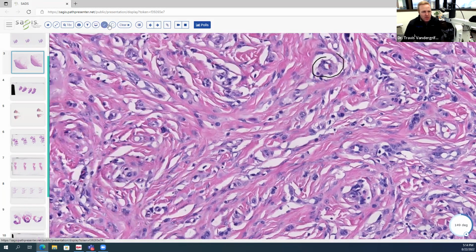In addition to that population of blood vessels, you also have in the stroma a proliferation of these epithelioid cells. And these are the cells that resemble what we saw in the nests of melanocytes in the papillary dermis. So these are melanocytes, and then these are blood vessels.